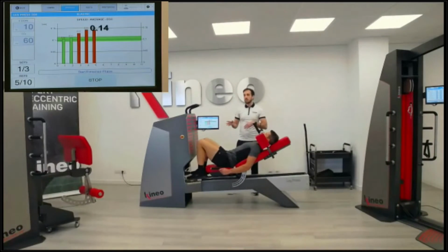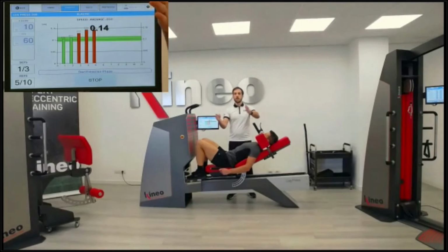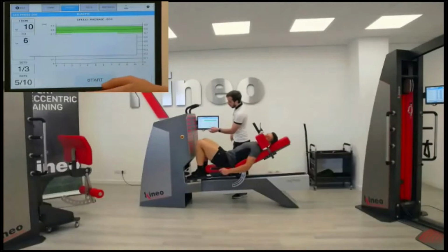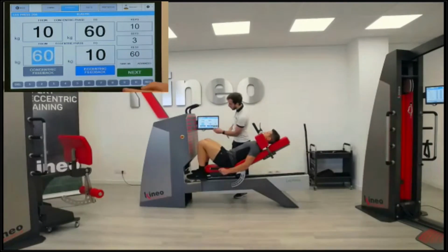So this was just a very quick example of how easy it is to make an elastic with objective loads. We select the first load, 10 kilograms, and we select the end of the range of motion. But of course, here the possibilities are very different. Like, for example, we could have something like this.